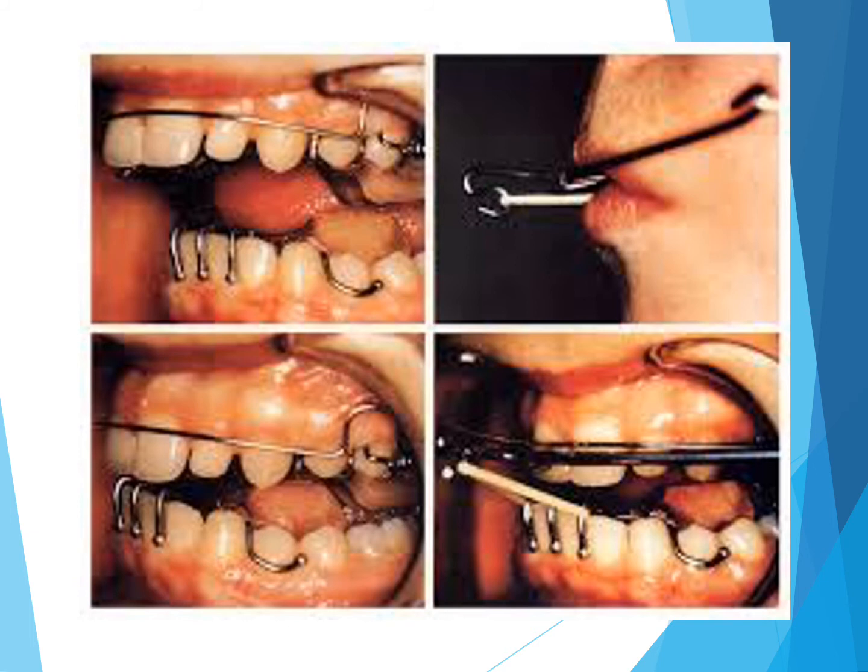This photo shows the patient wearing the twin block intraorally, attached with the Concord face bow as an extraoral traction. How to connect the Concord face bow to the twin block? The Concord face bow is connected through the upper maxillary molar. On the upper plate of the twin block, there is an Adam's clasp at the upper maxillary molar. A headgear tube is attached to the bridge of the Adam's clasp of the maxillary molar, and the Concord face bow is connected to the upper plate of the twin block by attaching through this headgear tube.